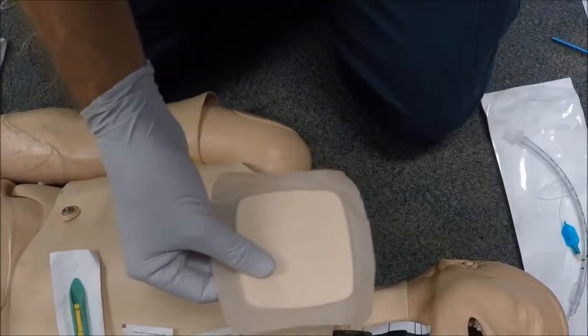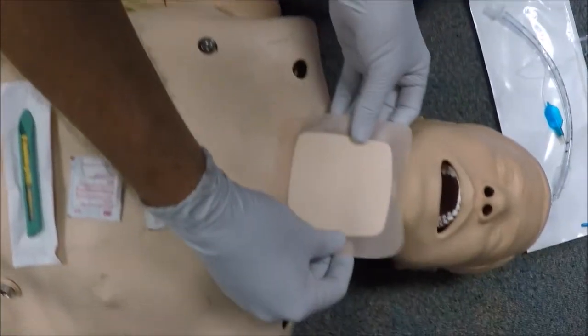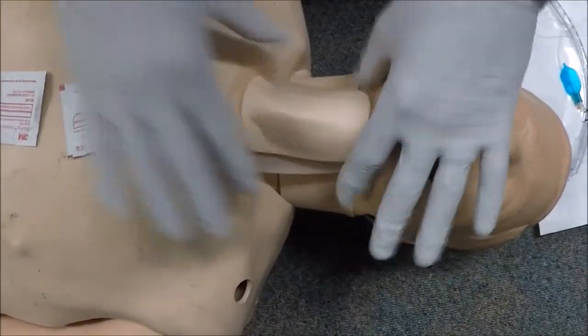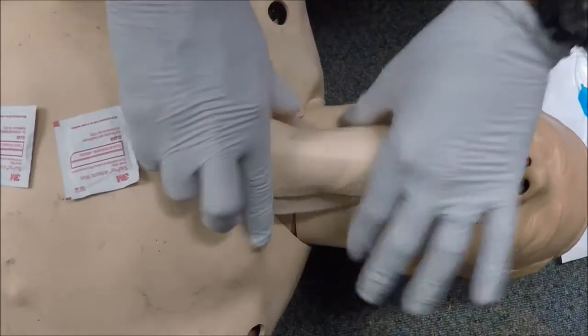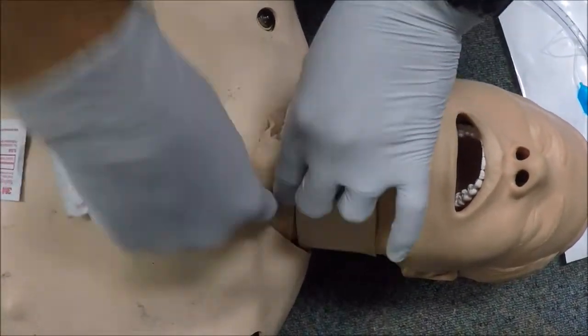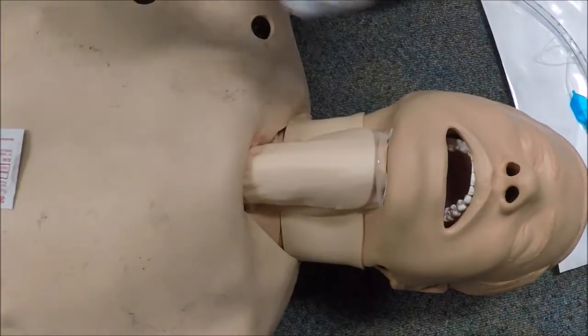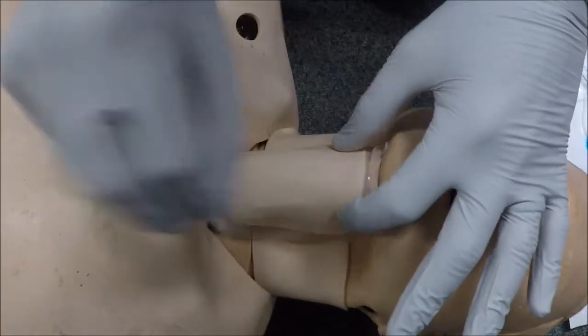So continuing the fashion of my homemade airway, I'm going to use this to simulate some skin over my airway so I can demonstrate the procedure of the cricothyroidotomy. Using aseptic technique, we'd swab the area.